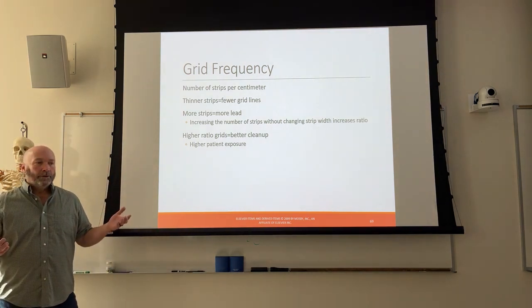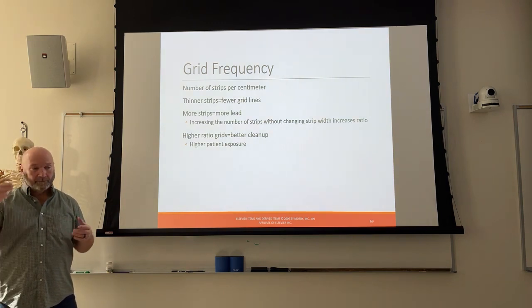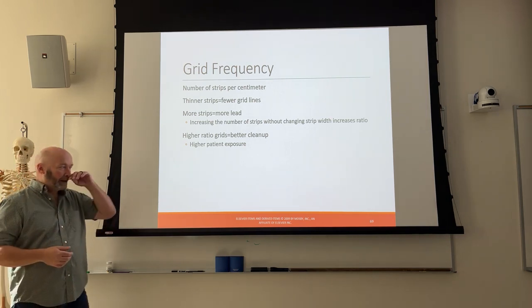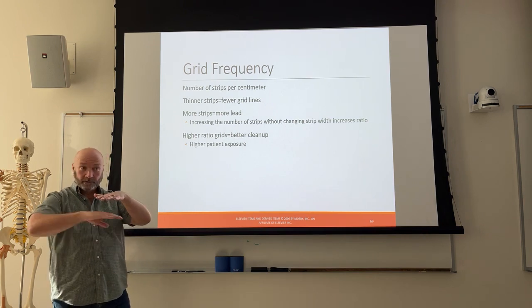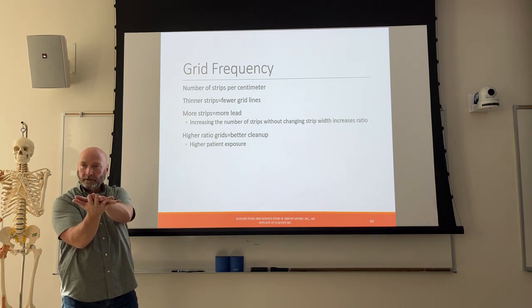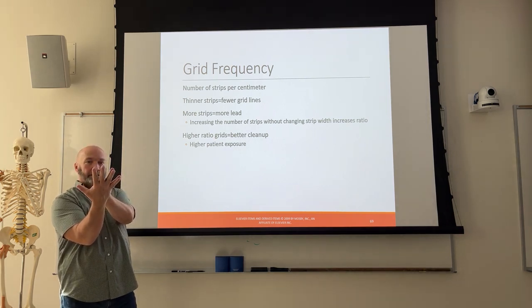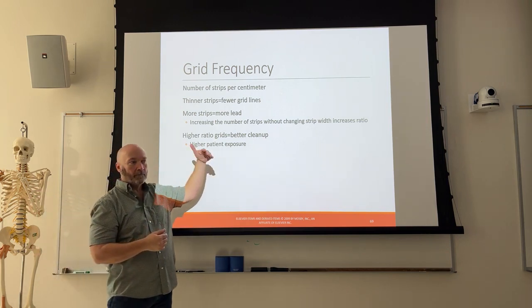So what they had to do was make that dissimilar. They couldn't really do anything with the CR reader for reasons we'll talk about later on, because to change the reader would be to change the resolution on the x-ray. Didn't want to do that. So what they did was they took our x-ray grids, which had relatively long hallways, they cut them in half, kind of like filleted them. Instead of having big, thick strips and wide hallways, they shuffled them together so that now we've got the same grid ratio with a much higher grid frequency. So the number of strips went from 5 in however many inches to 10 in about the same distance. Okay? Moire artifact went away. So grid frequency became more important.